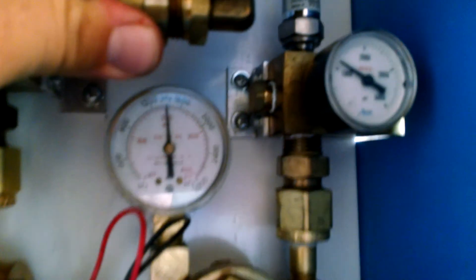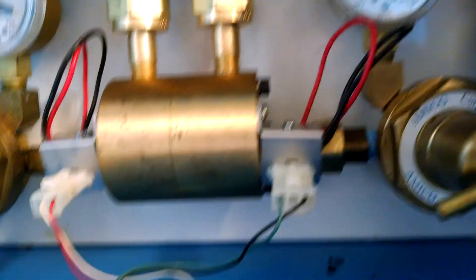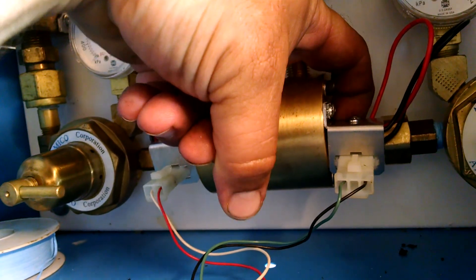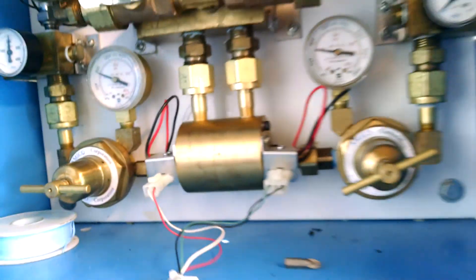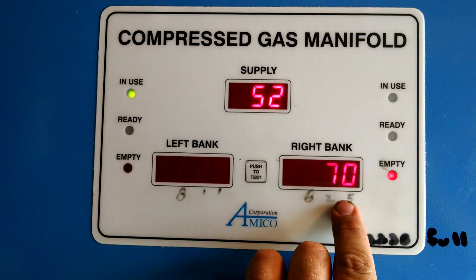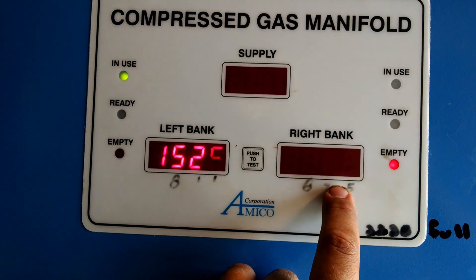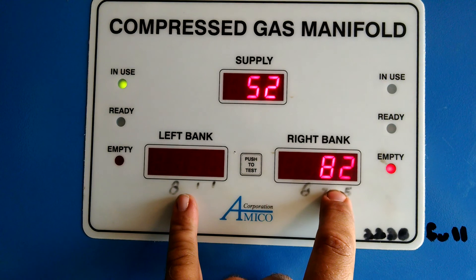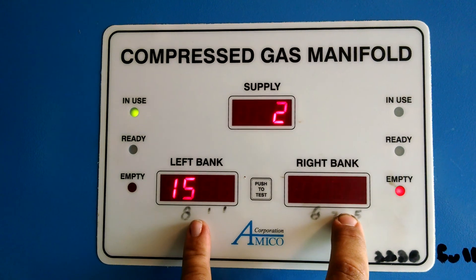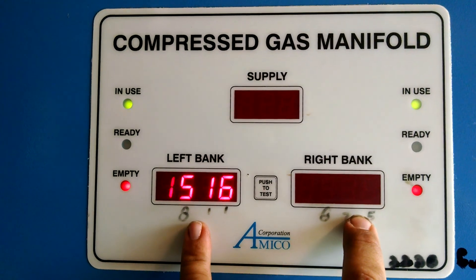I bleed the air off. It says low — leave it alone now, it's up to 70. Remember these are still off. It's up to 76. And it's going to flip back over to the right bank with only 90 pounds.